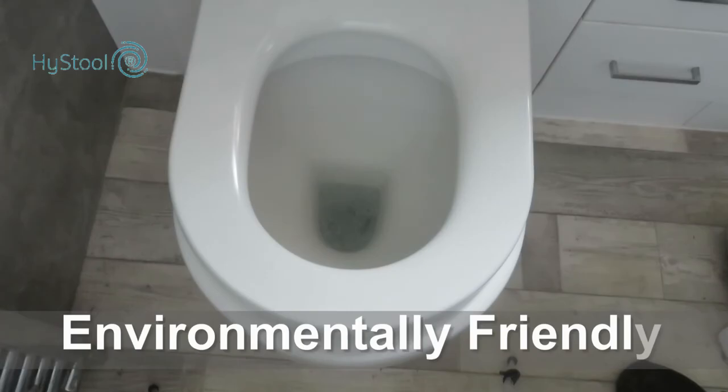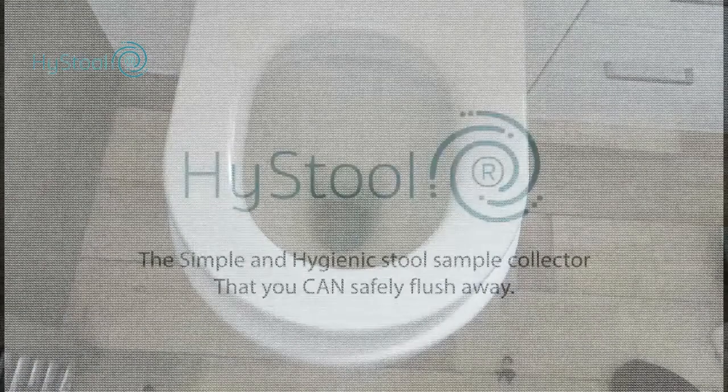PVA film is environmentally friendly and will totally dissolve in cold water, so it is a simple case of just flushing it away.